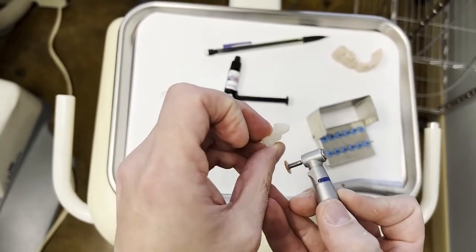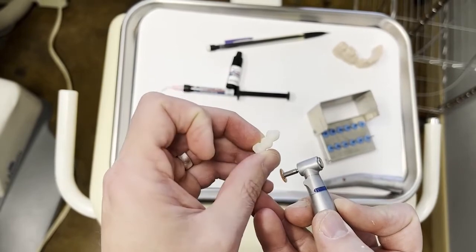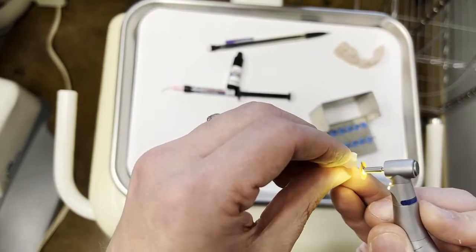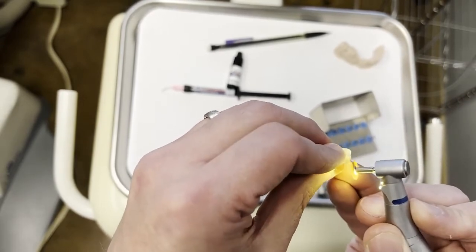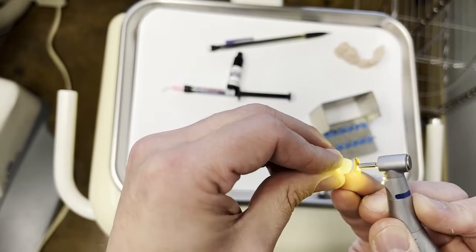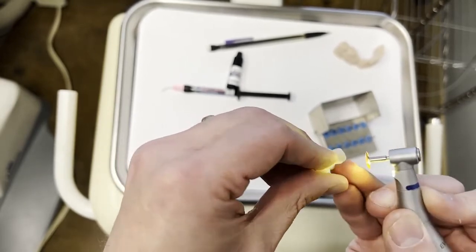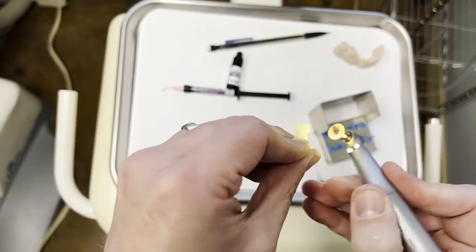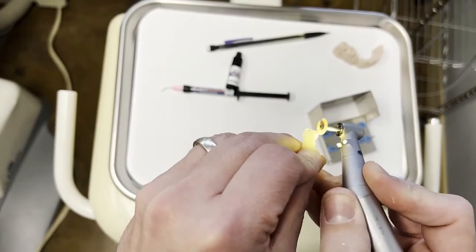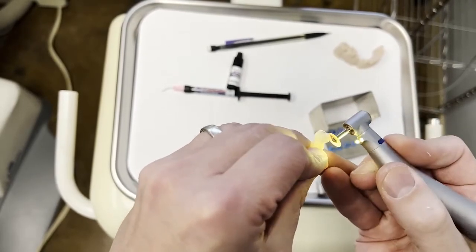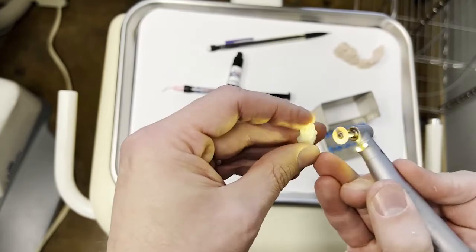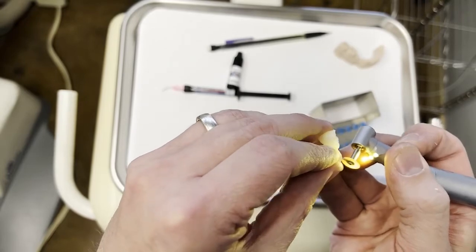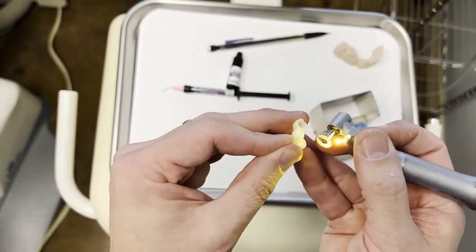So now you can see the difference there. We have much better contours there. Now let's work over here. Same thing. We're just going to kind of thin that area right around the contact, below it and around it. And so you still have a little bit of flash over here on this angle. And a disc does a really nice job of thinning that material out. I'm getting rid of that flash.